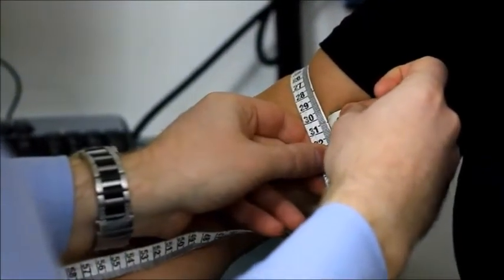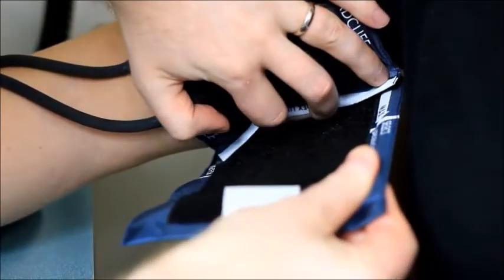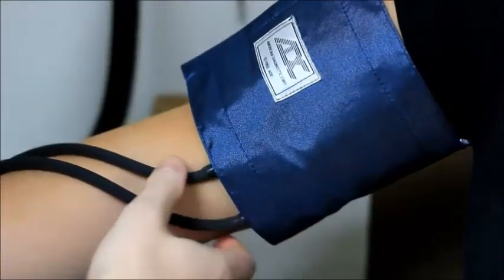The cuff will have the size range listed in centimeters. Once the correct cuff is selected, proper fit is verified using the index line that runs perpendicular to the length of the cuff and a range line that runs parallel to the length of the cuff.